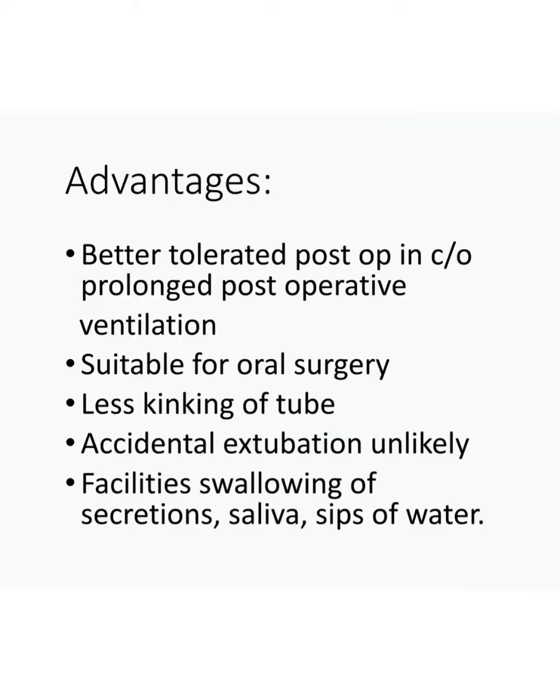Advantages of nasal intubation are: it is comfortable and better tolerated by the patient for prolonged intubation in the postoperative period. It is suitable for oral surgeries. There is less chance of kinking of the endotracheal tube when in the nose. Accidental extubation is unlikely with a nasal endotracheal tube. And it also facilitates swallowing of secretions, saliva and sips of water in a patient with nasal intubation in an ICU.